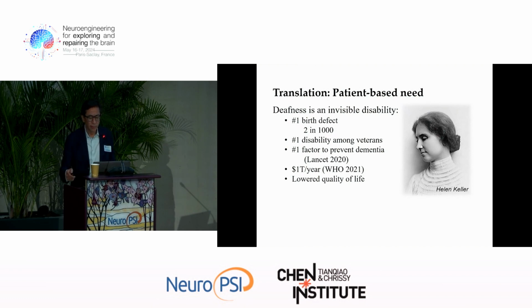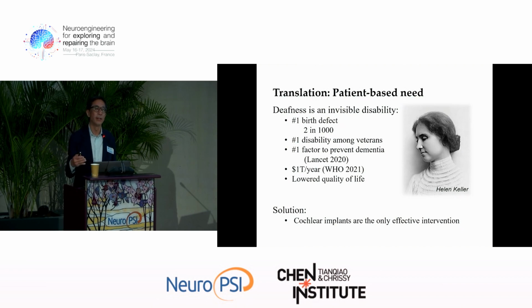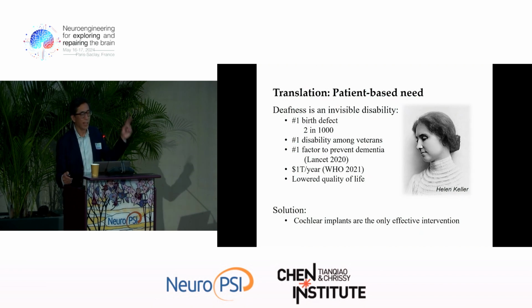So it's about the quality of life. And so far, the only medical intervention that can treat deafness is cochlear implantation. Nothing else, right? We're talking about total deafness. But if you go back and look at the history of cochlear implant development, and this is the second part, I'm trying to get into the interplay.